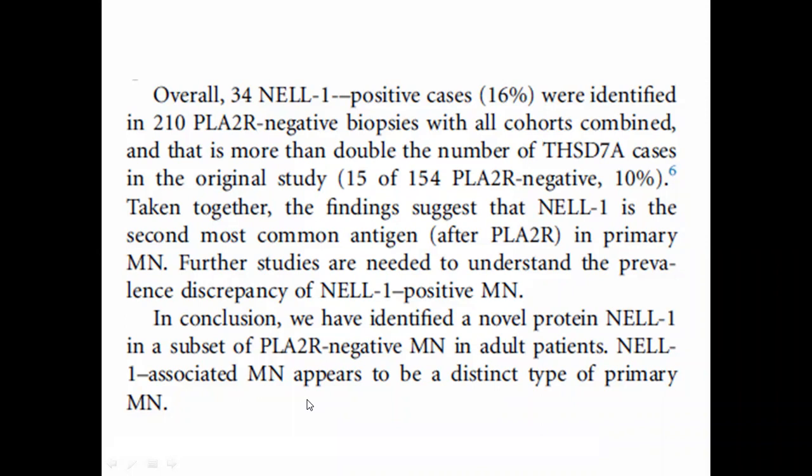It is a very simple kind of thing: if you compare it with the non-atrophic tubular basement membrane, it is a rough sign. When we label anything as glomerular basement membrane thickness, we just compare it with the non-atrophic tubular basement membrane. But yes, the ideal is to get the GBM thickness done, which can be done on ultrastructure examination. There is no cutoff for GBM thickness, like if GBM thickness is this, then it is membranous. GBM thickness utility is mainly when we deal with thin basement membrane disease. And that diagnosis, as we know, is made only on ultrastructure examination.